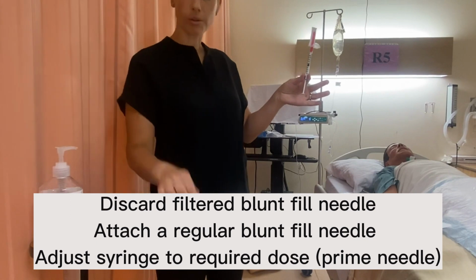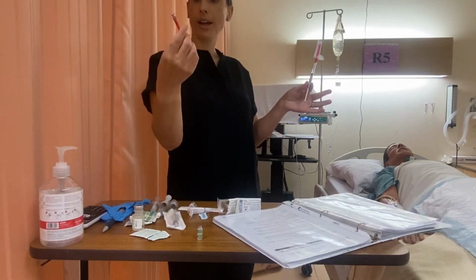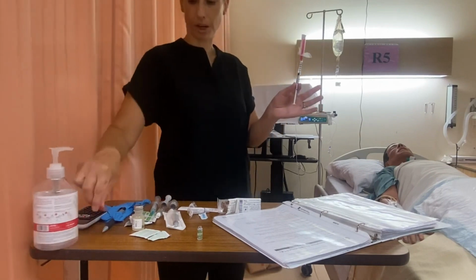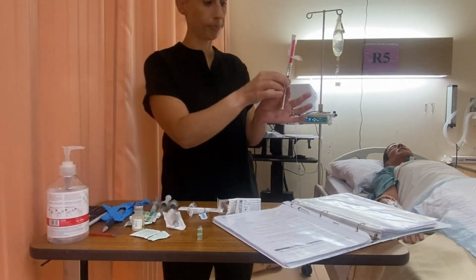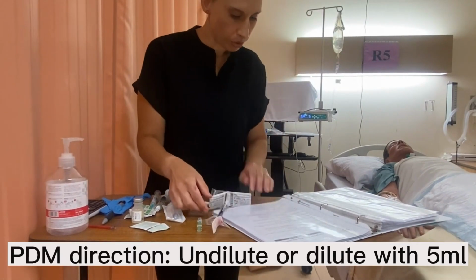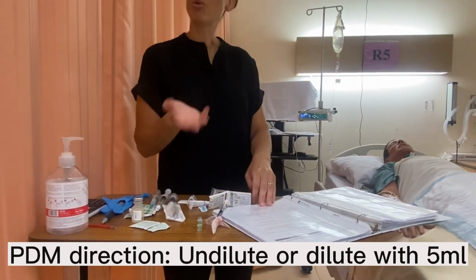Okay. And then with this one, we put it in the sharps container. And remember, there's glass particles in there, so we're not injecting it. We're throwing that one out into the sharps container. Okay. So 0.5 mLs. Okay, and then when we review our PDM, administer undiluted or diluted.